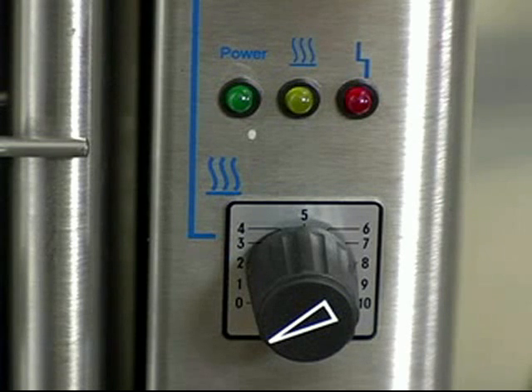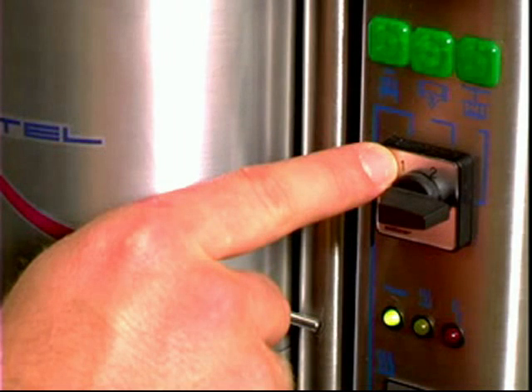The round knob is the heating element. It goes from 1 to 10, depending on how quickly you would like the alloy to melt. The rotary switch is for executing the casting.